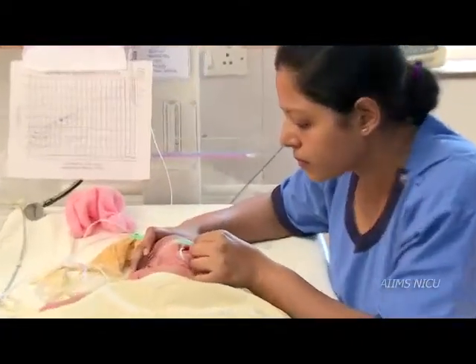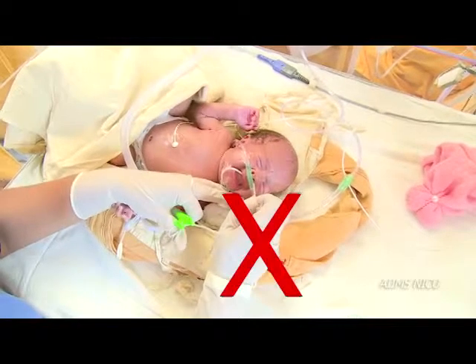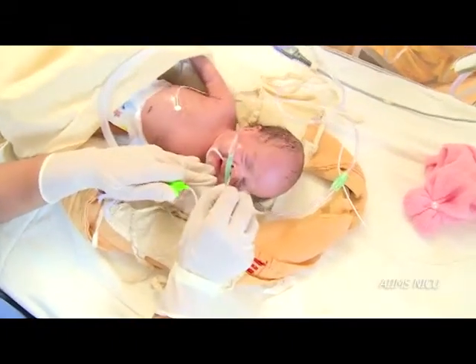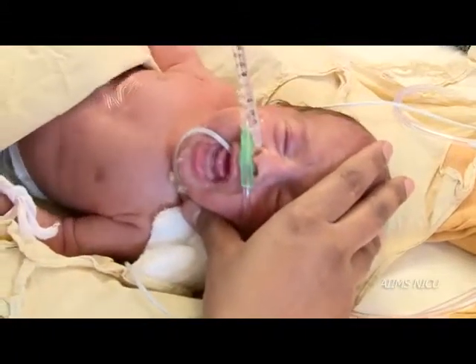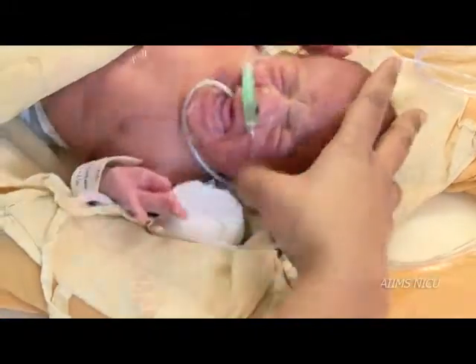Nasal cannula should be periodically checked for visible block. Routine nasal suction is not recommended, however, it may be required in presence of secretions. One may also need to put 1 to 2 drops of saline in the nostrils to avoid drying of nasal secretions.